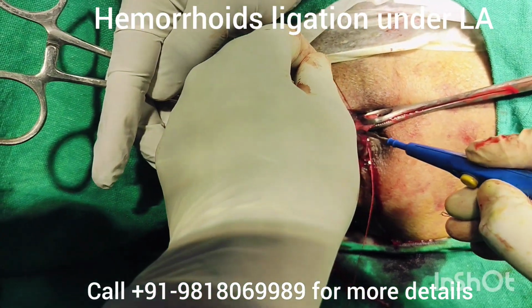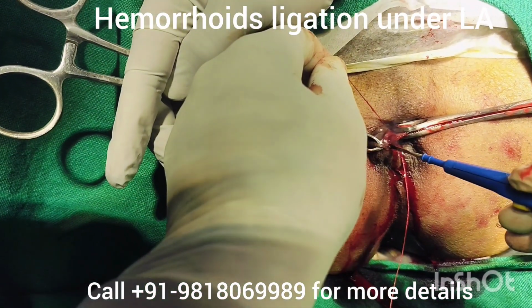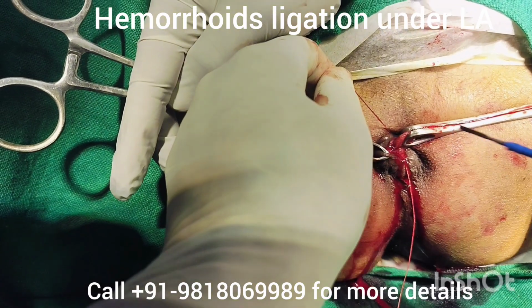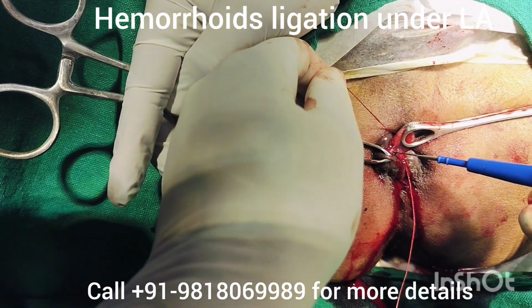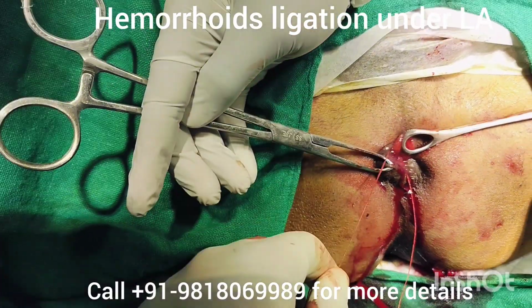Now again I have used this cautery to separate the pile mass mucosa from skin. Then we'll ligate it.